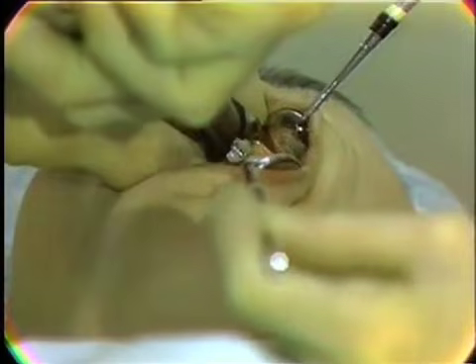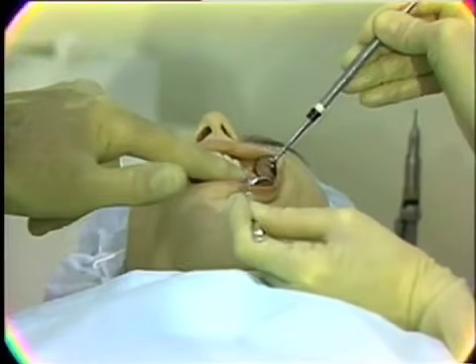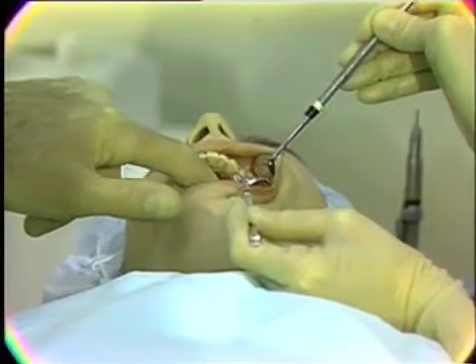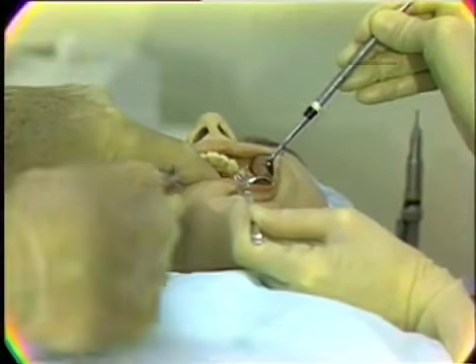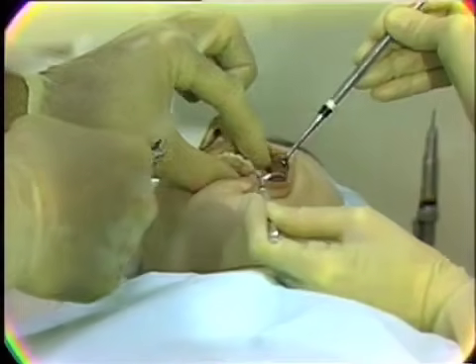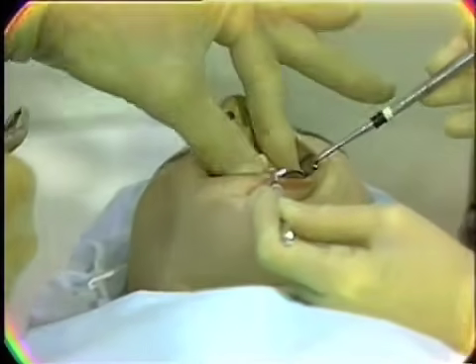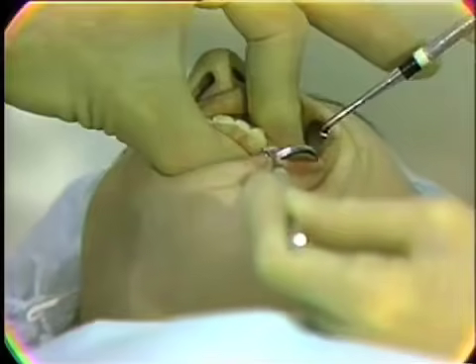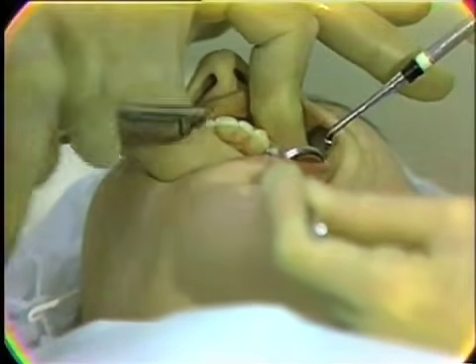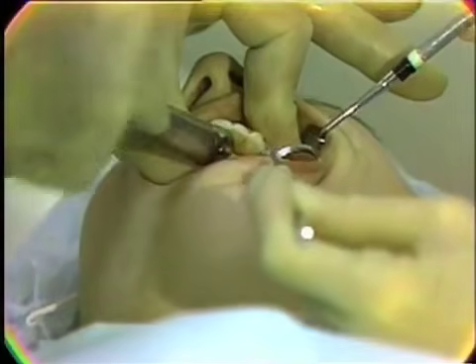in this manner. Now, as we apply forces to the maxilla, it is our hope to control the position of the head so that when the forces are applied, the tooth is moved and the head is not moved. Therefore, if you will place your finger on the buccal surface and your thumb on the palatal surface, you'll be able to so engage the alveolar process that you can support it, and you'll have an index of how much pressure you are using as you attempt to luxate the tooth.